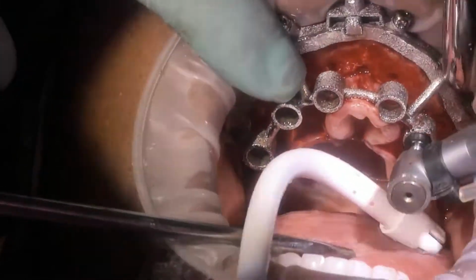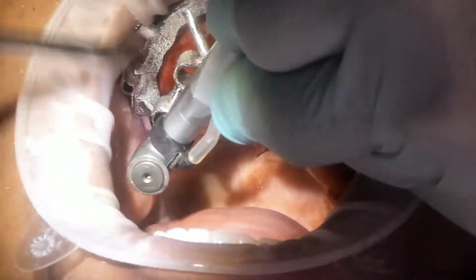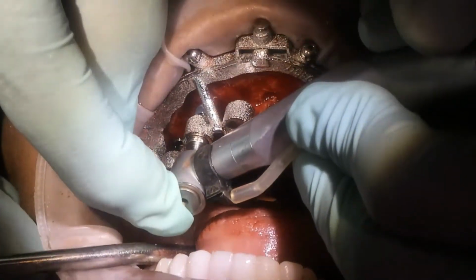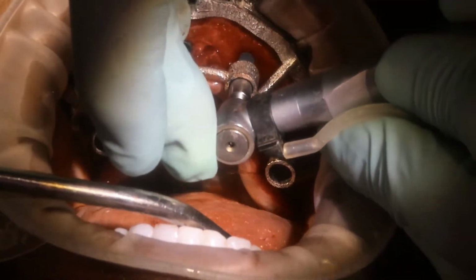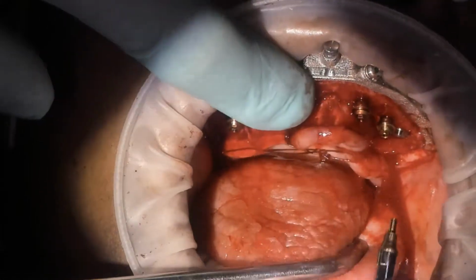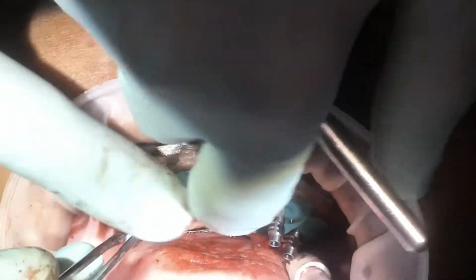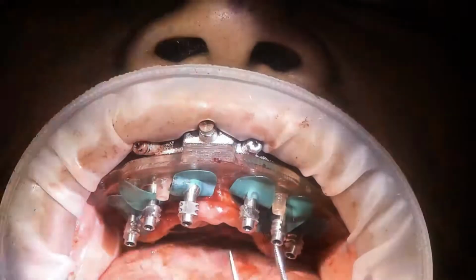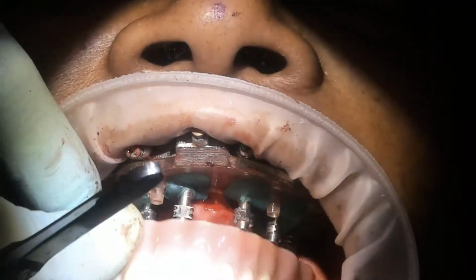Then the osteotomy guide is seated and all the sites are drilled as normal Chrome protocol. The implants are placed, and just like many systems, this system allows the implant to be placed through the surgical guide. Once the implants have been placed, the carrier guide is reinserted and the multi-unit abutments are placed, as well as the temporary cylinders. In this case, the doctor used impression posts, and they are all tightened down, and the green gaskets are used to block out the carrier guide, and the prosthetic is inserted, and the prosthetic conversion begins.